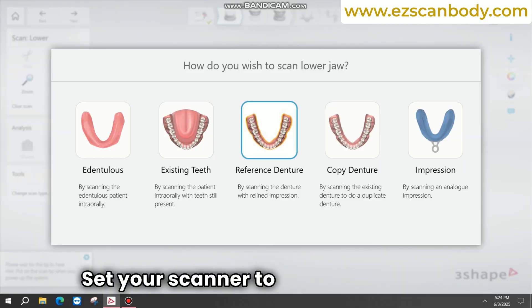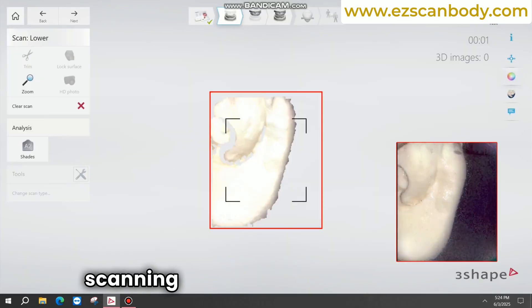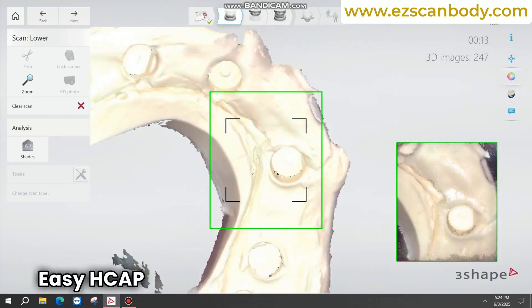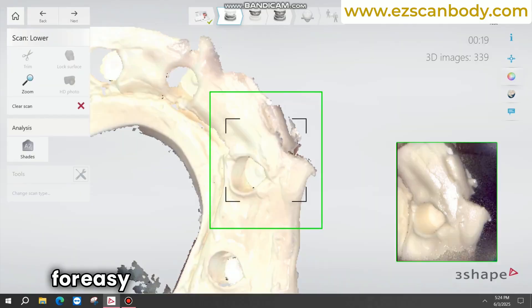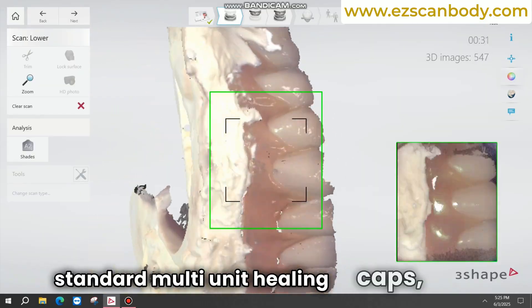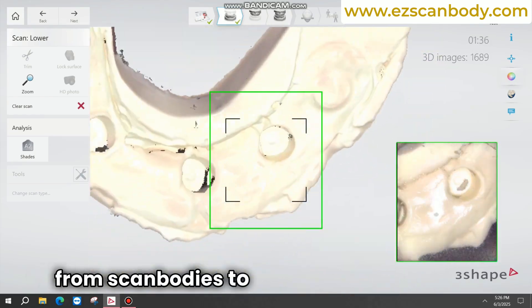Set your scanner to perform a 360-degree scan of the relined denture, ensuring thorough scanning of all scan bodies. Easy H-CAP ScanBodies are designed for easy scanning and function as standard multi-unit healing caps, saving time during the transition from scan bodies to healing caps.